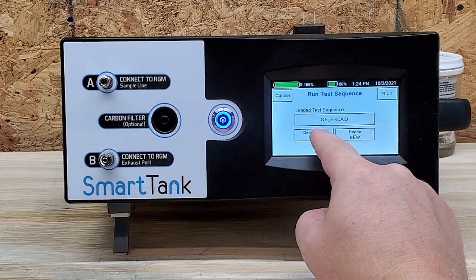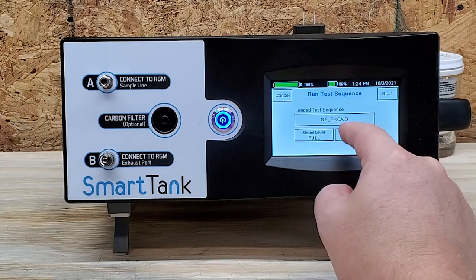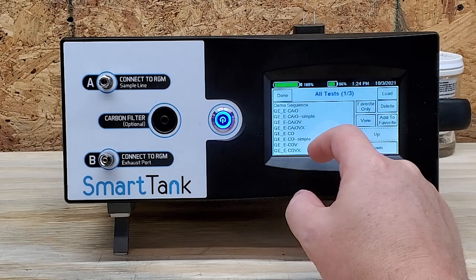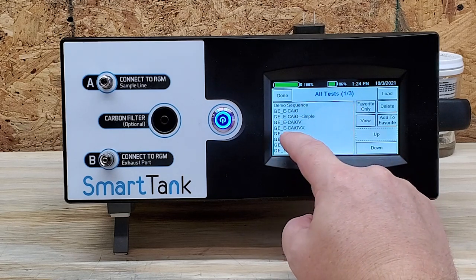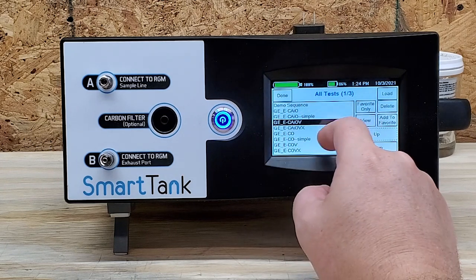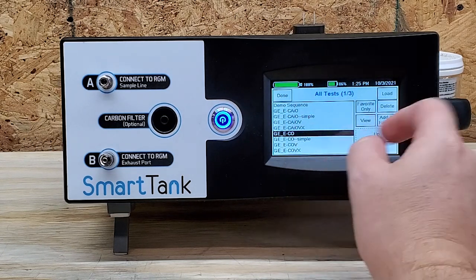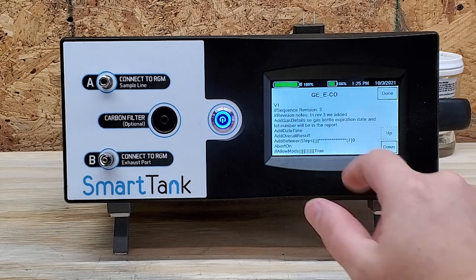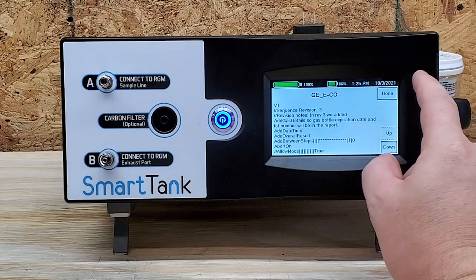Let's see — detail level: Full or Brief. We'll go into Full detail. These are all the different types of GE modules: the GE E-CO, GE E-CAO, GE E-COV. Let's try E-CO, that's one of the most common. So it's going to add the bottle expiration date and the lot number in the report — I like it.